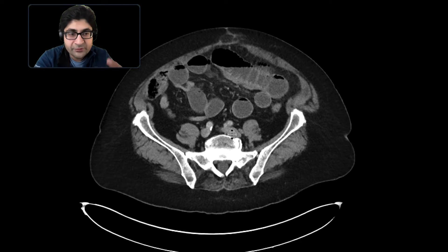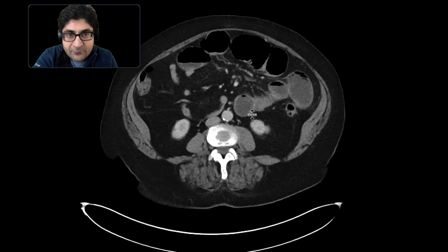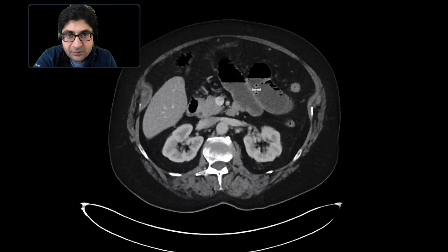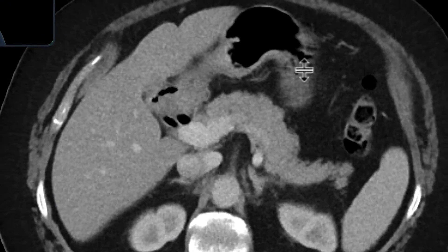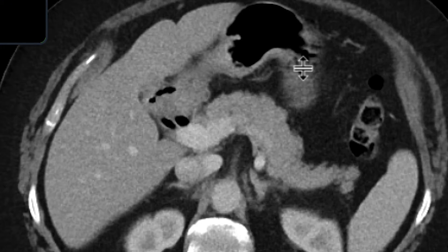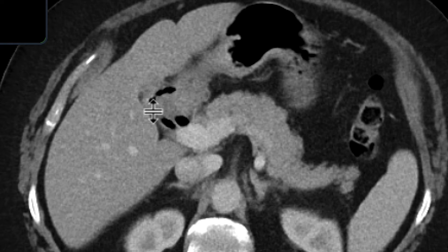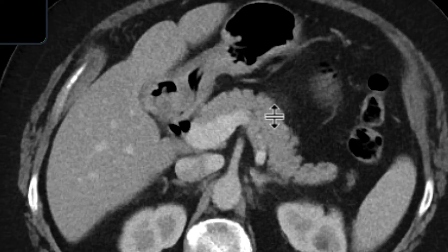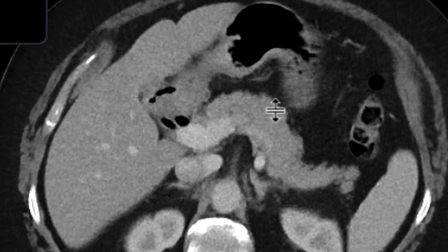So clearly, we're dealing with a small bowel obstruction. Looking more closely, the gallbladder is quite contracted and contains gas — pneumobilia. And right around there, there's a little tract or fistula between the gallbladder and the duodenum that's filled with air.